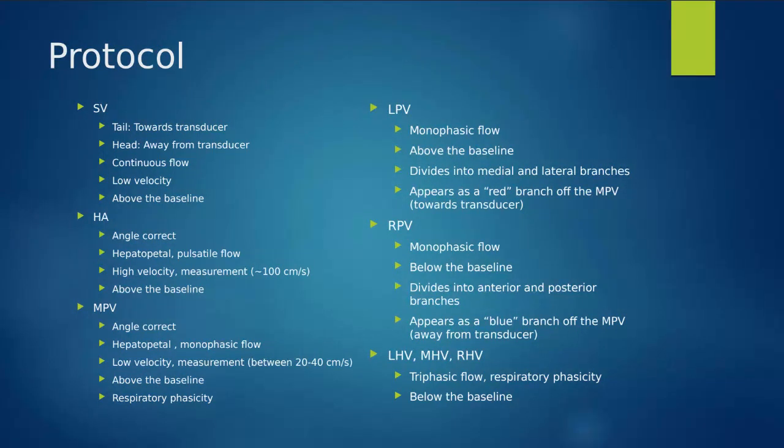Now, at the tail of the pancreas, as we know, when we're putting color Doppler on that pancreas at that splenic vein, it's going to appear like it is traveling towards the transducer.